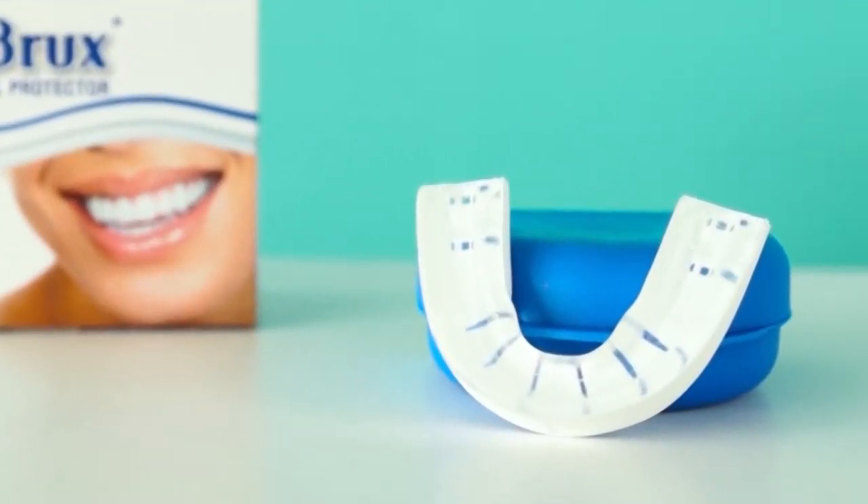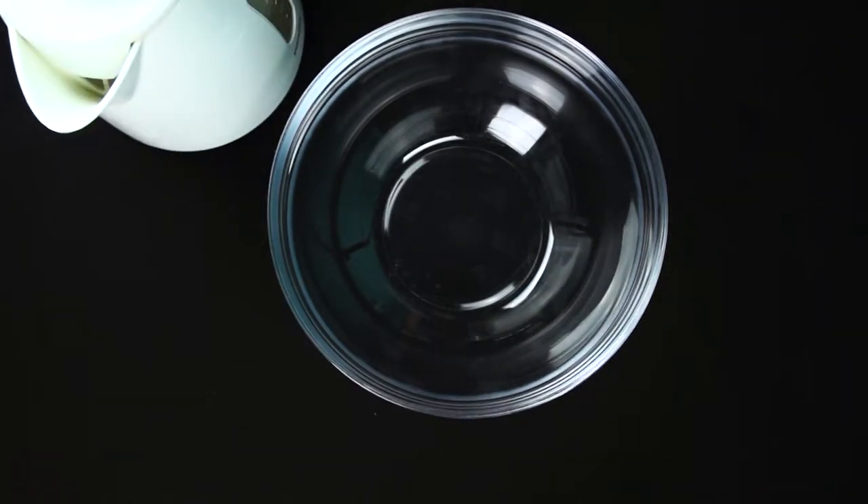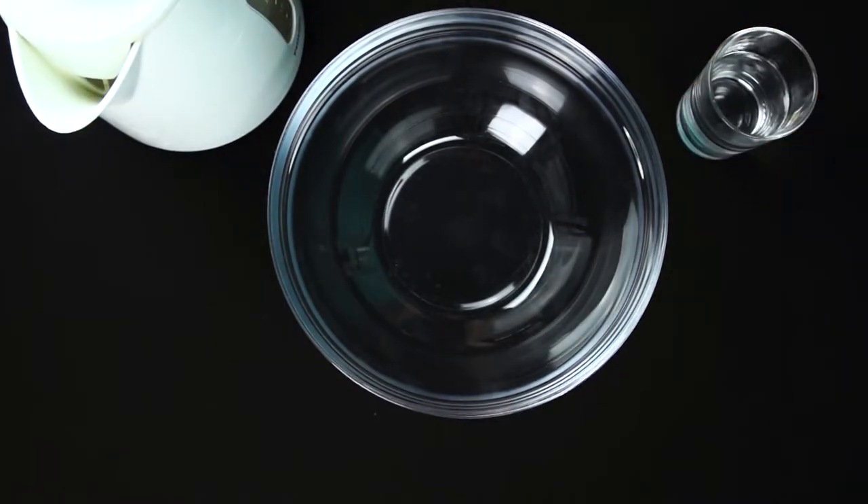SomniShop shows you how to fit the product correctly. Prepare the following items for the fitting procedure: a mid-sized heat-resistant bowl, approximately 1.5 litres of boiling water, and a half glass of lukewarm tap water.